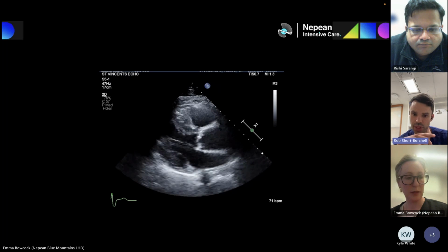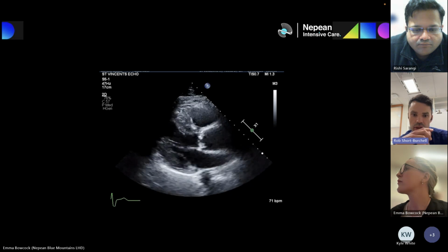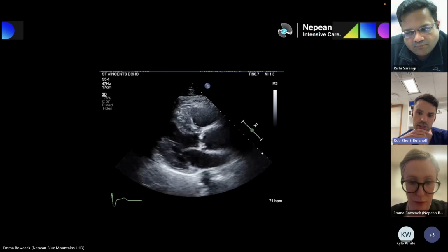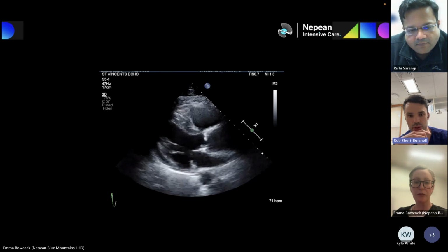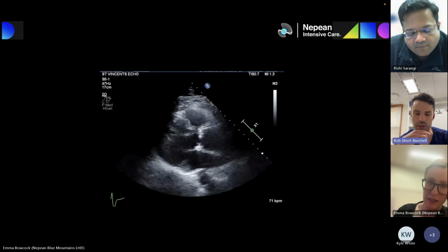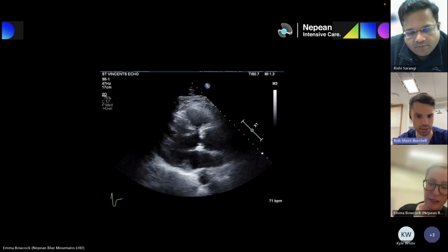The right ventricular outflow tract, the ascending aorta or aortic root and left atrium are approximately the same size, although the aortic root does look like it might be dilated, and looks like the STJ is effaced in this view. And then concentrating on the aortic valve, it appears heavily calcified and there's restricted motion during systole. So I'd want to interrogate that with a zoomed in view and from other axes.